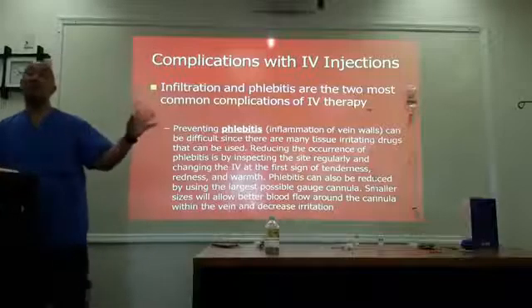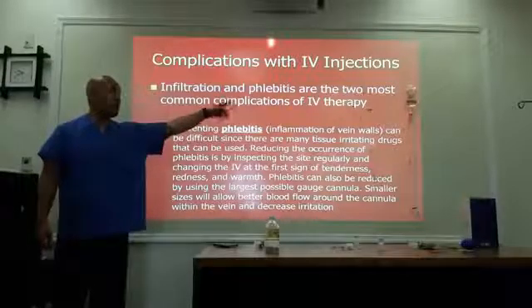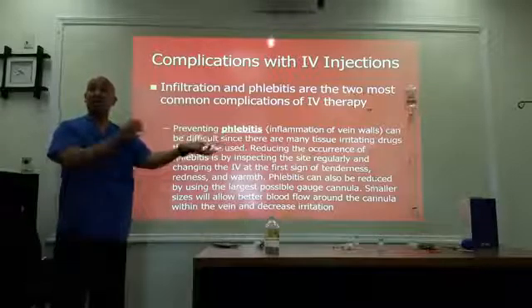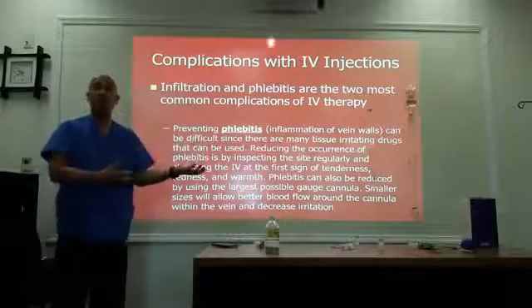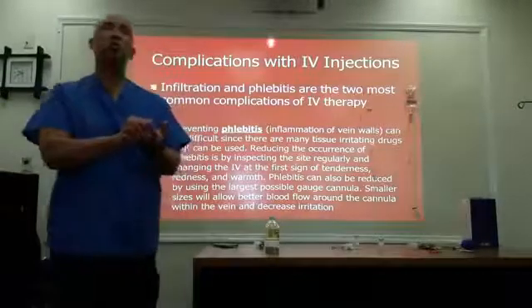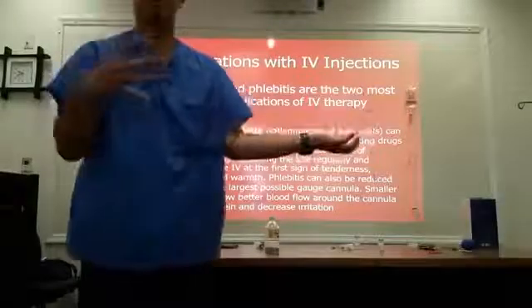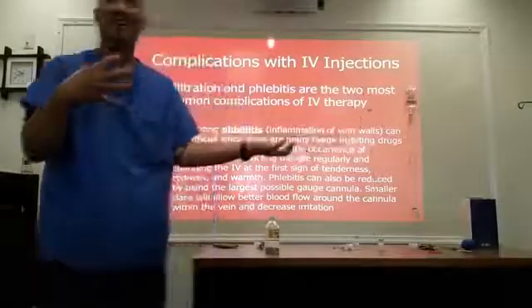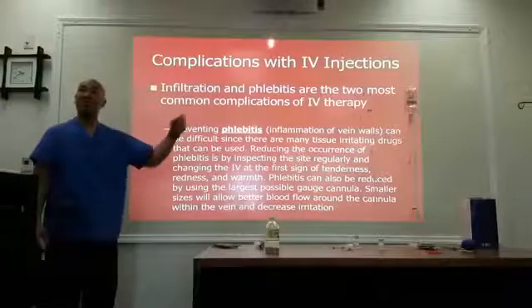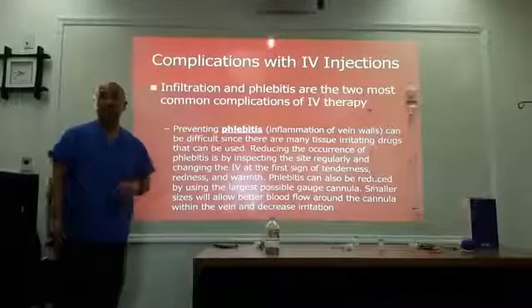So again, if you're having somebody who has a drip infusion, so they're getting infused with a drip, regularly check the site to make sure that there isn't any type of redness going on, making sure that there isn't any infiltration going on. When you're doing the direct push method, you'll see it infiltrate right away. You'll just see the skin pop up and you're like, oh damn. Okay, sorry about that. But when it's infusing, you don't see it right away. So when that occurs, you need to stop what you're doing.